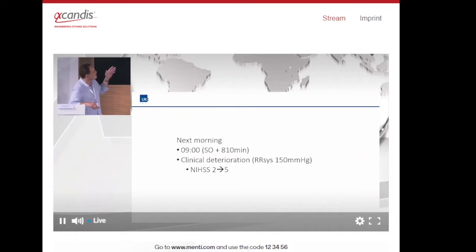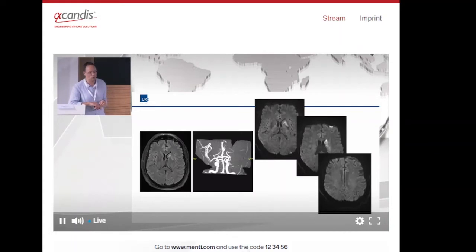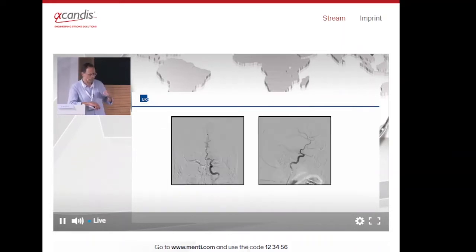And at that moment, we decided not to take him to angio directly, what you actually could do in my opinion, but to do an MRI. And what we see is a very small infarction on FLAIR. We see an occlusion in native time-of-flight angiography, and we see this little lenticular infarction, and we see little embolic but hemodynamic infarction. We took the patient to angio. At the beginning, those images aren't that good. We usually start with no sedation when it's possible. It was possible in this patient.